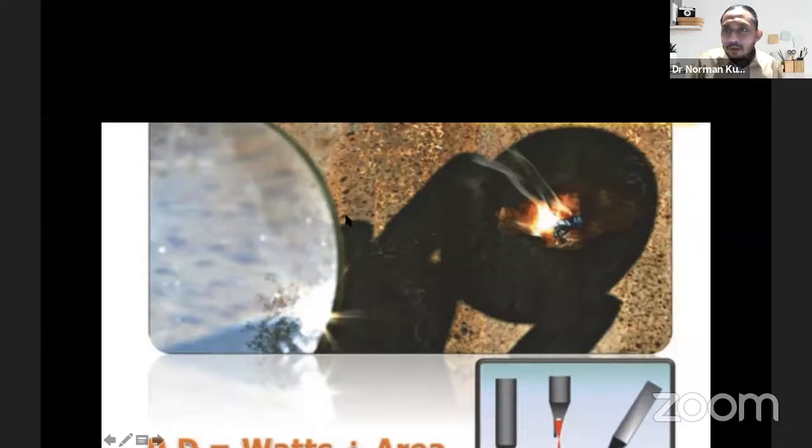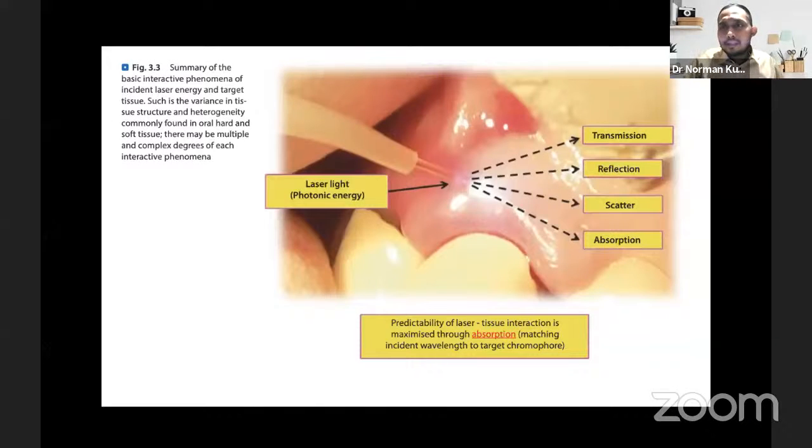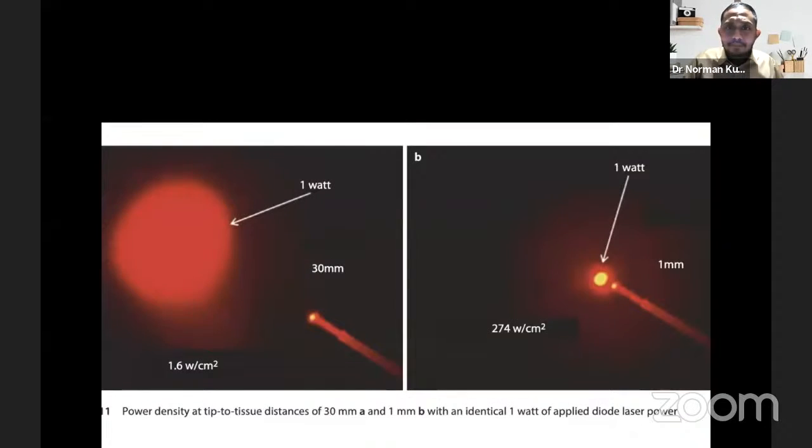We call it laser radiation, and it's really enjoyable. So this is a graphic. As you can see, there are diode, neodymium YAG, erbium, and also CO2 and excimer lasers. A diode laser is a laser that can be well absorbed in melanin and hemoglobin. We also see there are many benefits here. So maybe Dr. Ellie will soon show her case about the laser.